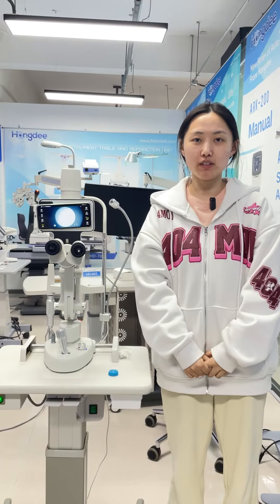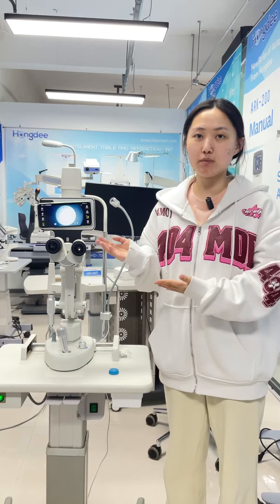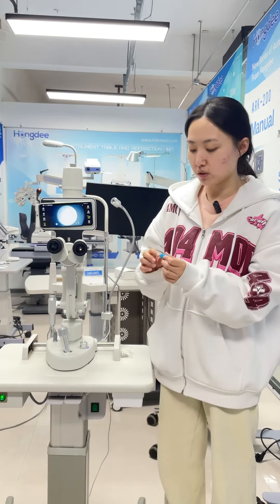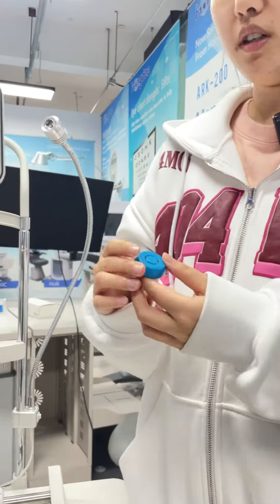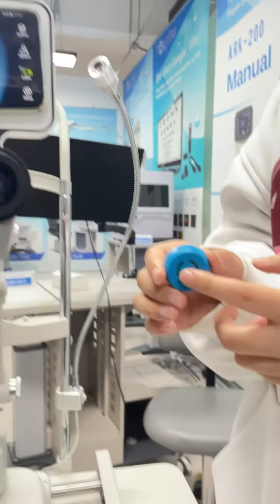Hello, this is Judith with Hongdee Corporation. Now I will introduce our slit lamp imaging module Phonto. I will show you how to take a picture or video. We need to use this shutter button.